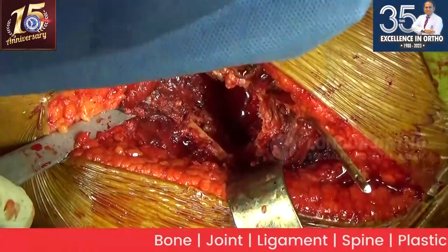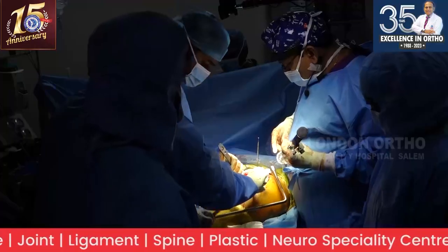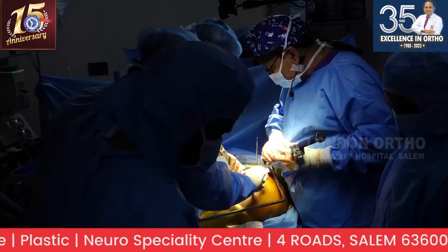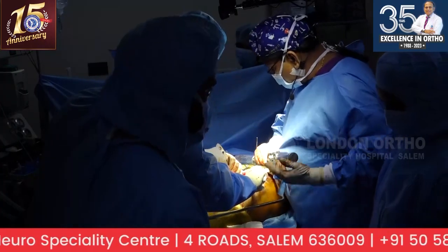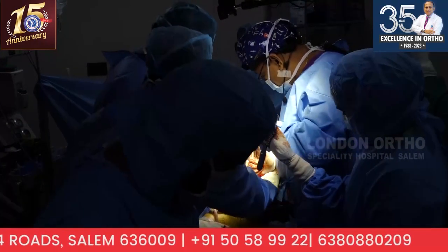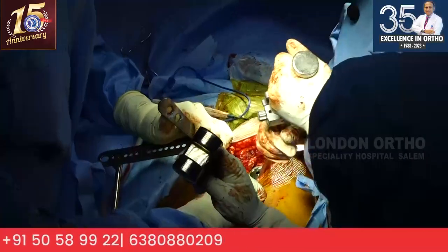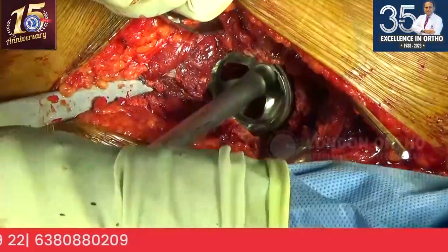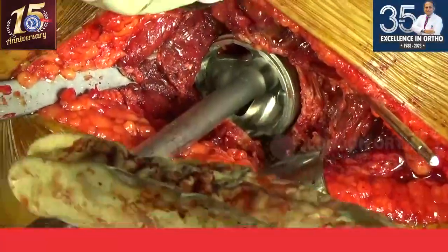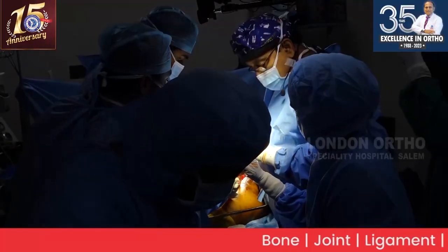Okay. Trial. I want to try 48. Considering her young age, do you want to bone graft the medial wall, sir? Yes, the head is getting bone graft, getting ready. Yeah, that was my worry. That's why I initially said I want to shy away from the medial for that moment. But now the sclerotic bone gave in fairly easily, so we are at a fairly hemispherical shape. Hit it, please.